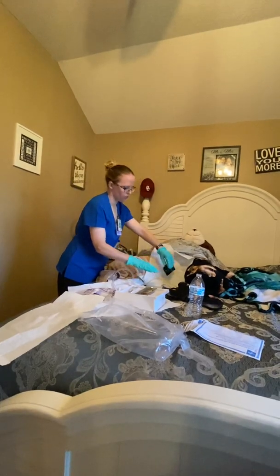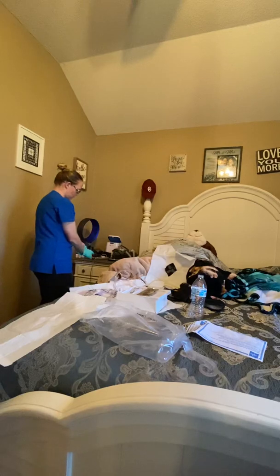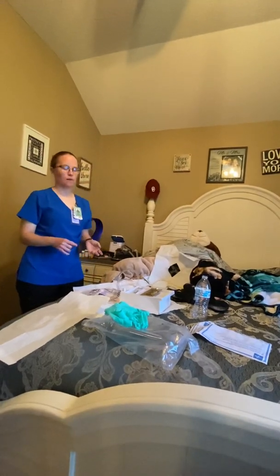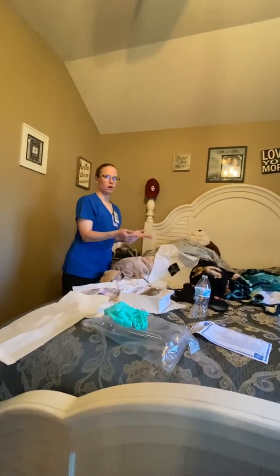So what we'll do is take off our gloves. I'm going to throw these away, and we're going to perform hand hygiene. And then we'll don a new pair of gloves. We're also going to make sure to secure the catheter to the patient's leg. For a female, we can attach it to their leg. For a male, it can be their upper thigh or their abdomen.